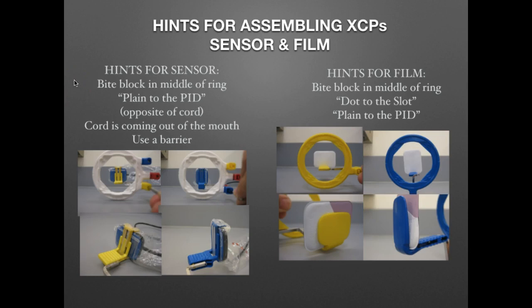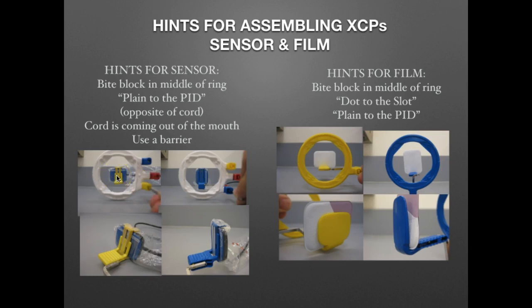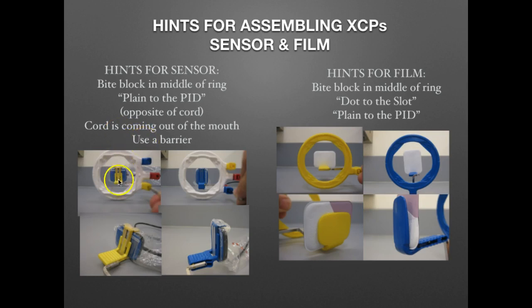Here are a few hints for assembling your XCP to ensure diagnostic quality images. For the sensor, make sure the bite block is in the middle of the ring once you assemble the bite block and ring onto the rod, and confirm you can see your sensor centered in the ring for both posterior and anterior. Make sure the flat side of the sensor faces the PID — that is the opposite side from the cord — and ensure the cord exits the patient's mouth properly. Use a barrier on your sensor for infection control.